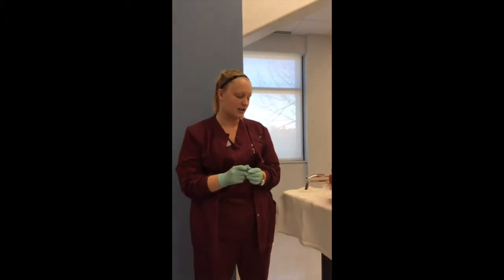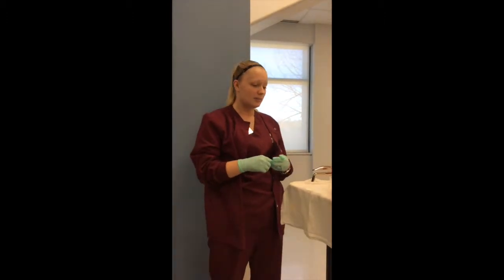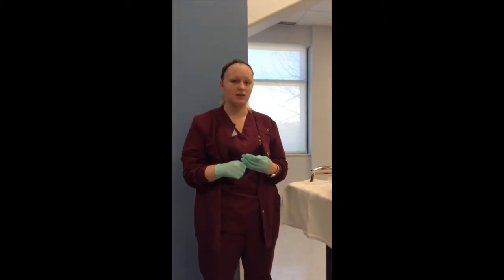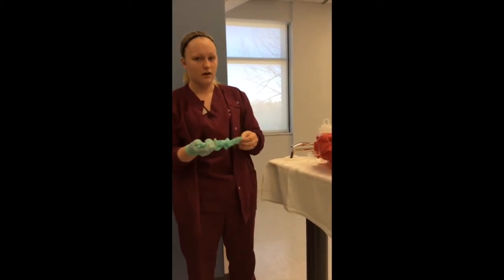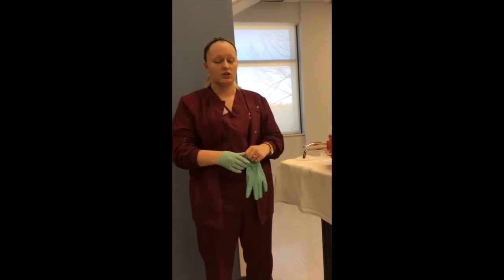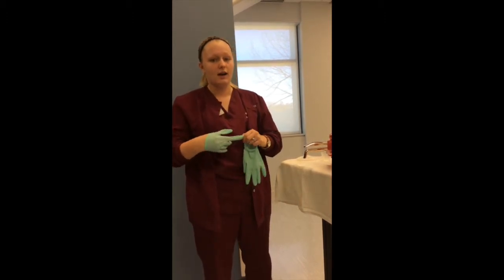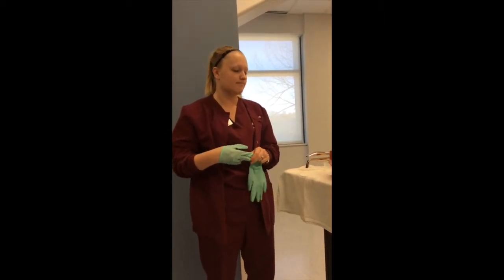I'm going to tell my patient if they have any side effects to let me know. Whenever I'm documenting, I'm going to document, of course, the medication, the route, any complications. I'm also going to document the residual volume and all of that. And finally, I'm going to document on the I&O how much I put in. That way I know whenever things are coming out, how much I put in, of course.